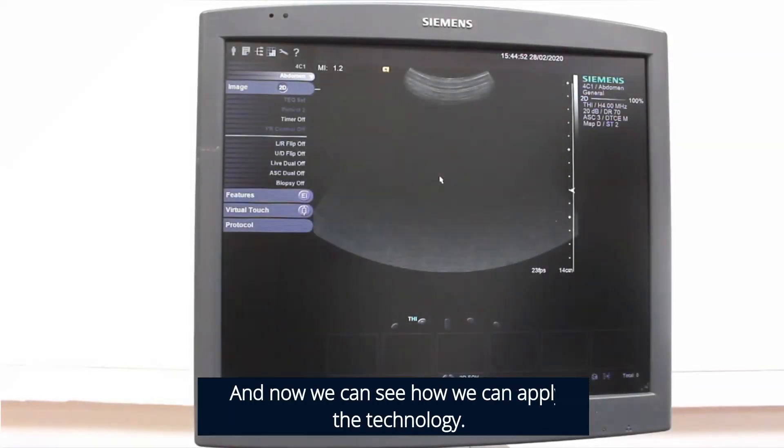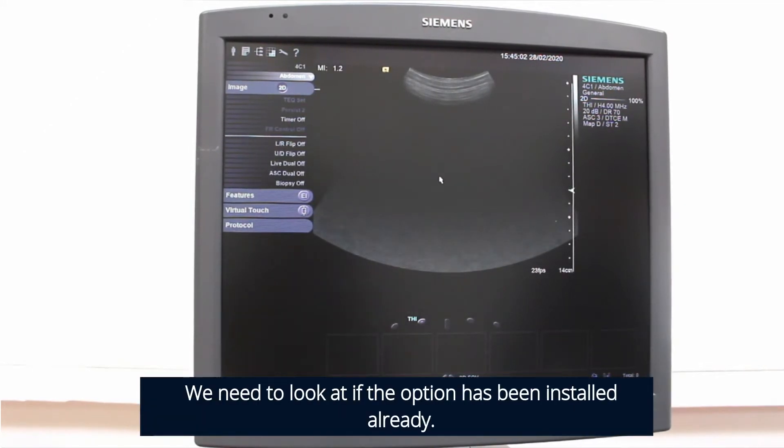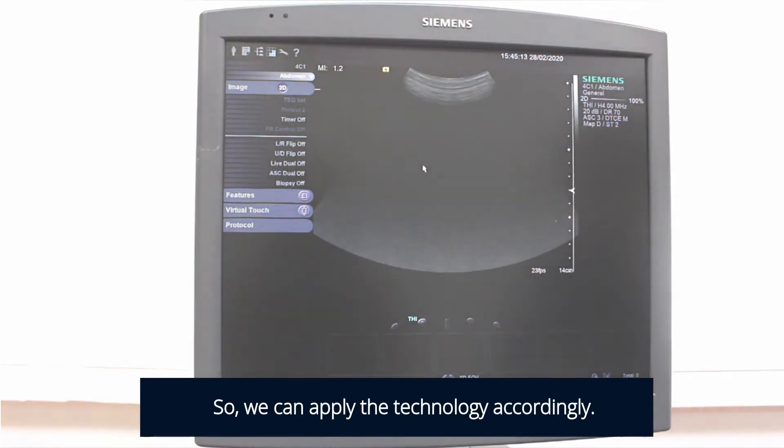Now we see how we can apply the technology. We need to look at whether the options have been installed already. We can see the RFI option is installed on the machine correctly, so we can apply the technology accordingly.